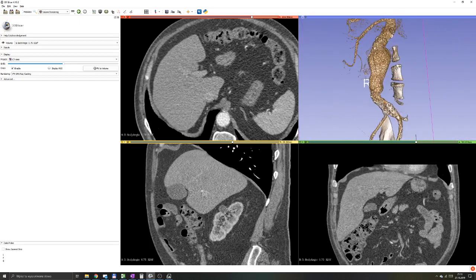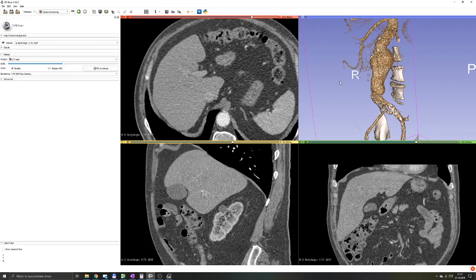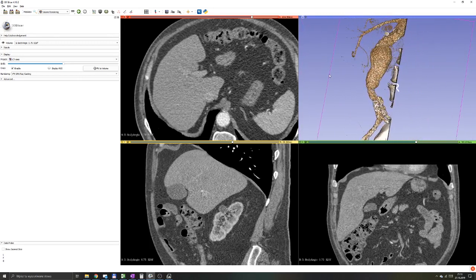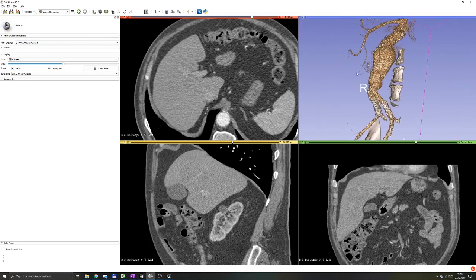In many cases it will be satisfactory. But again, this is not a mesh and that means it is not 3D printable. If you want to make a quick screenshot for your clinician, you can go with volume rendering — it will be very quick. But if you want to make a segmentation, 3D print the model, or calculate the volume, you have to go through segmentation and surface rendering.